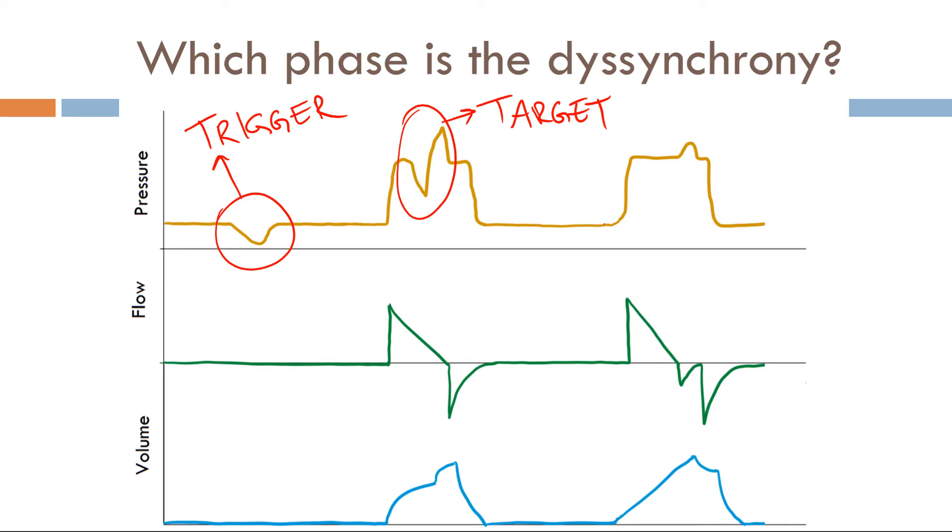Now continuing along here, another triggered breath. There's no issues with target, but there is an issue at the end of inspiration for the cycle phase. Therefore, this is a cycle dyssynchrony.